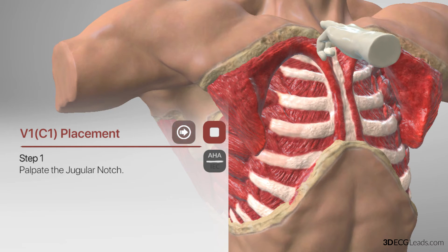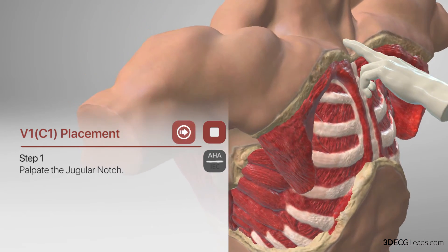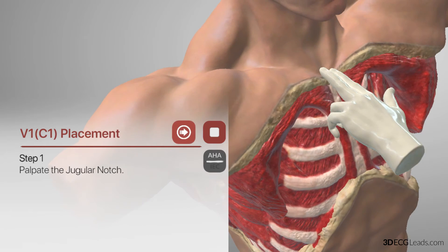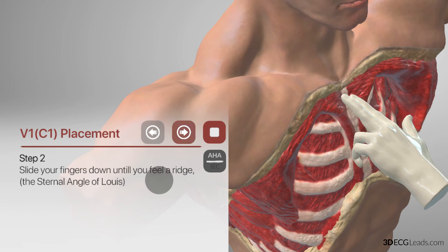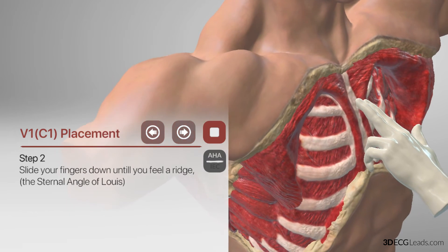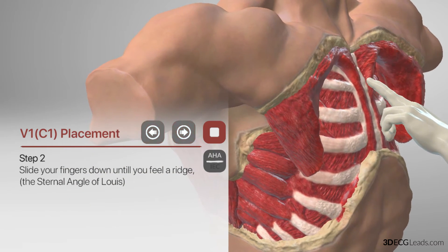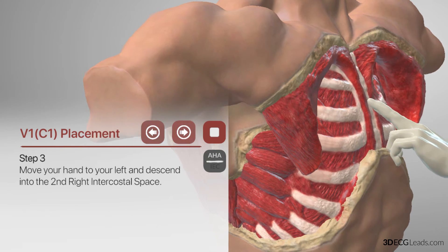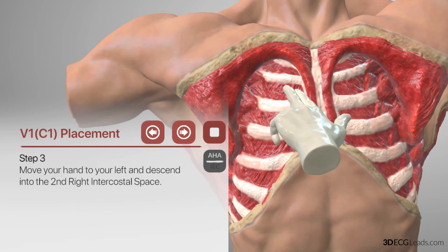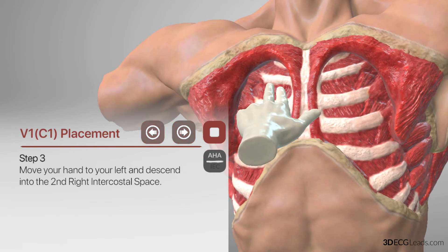The first step in the placement of V1 is to identify what we call the jugular notch of the sternum. That is the depression that you can feel at the base of the neck on the top of the sternum. From there, the second step is to slide your fingers down until you feel a slight elevation. This is the sternal angle of Louis. From here, move your hand slightly to the left and downward, but stop when you reach the first depression. This is the right second intercostal space.